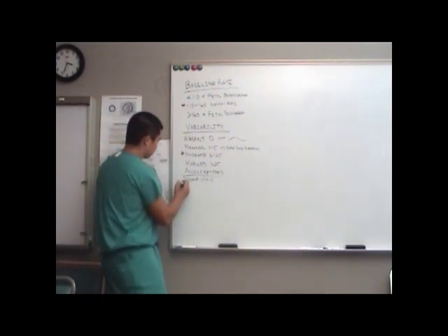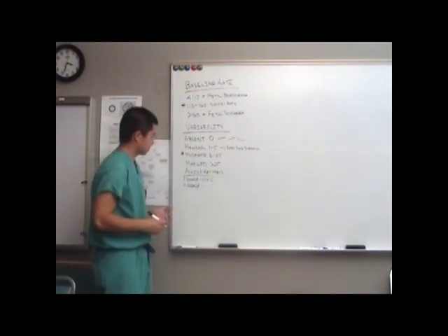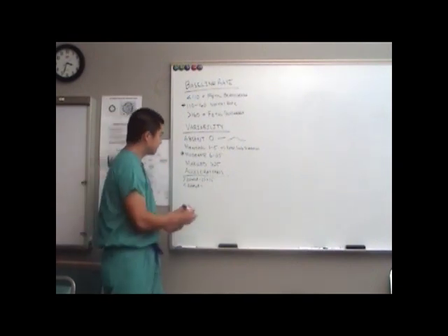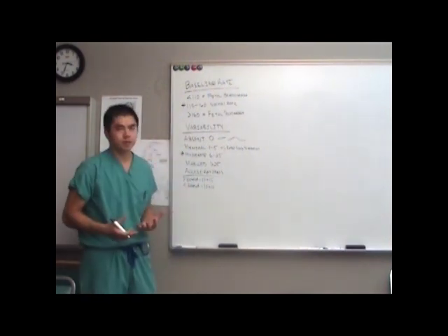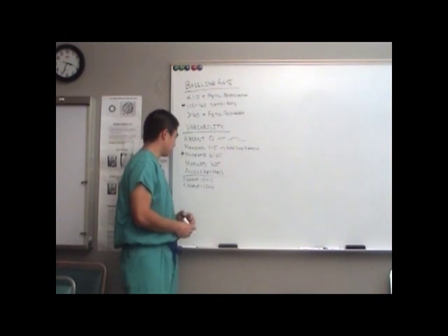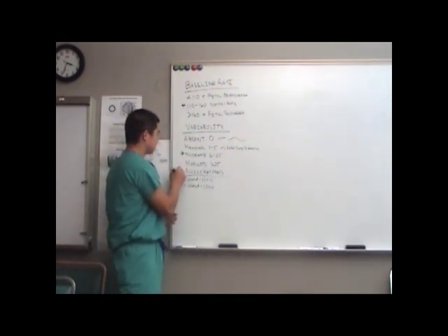Good. Now, if they were less than 32 weeks gestational age, what's the definition? 10 by 10, which is how many boxes by how many boxes? 1 by 1, okay? And so this is above your baseline rate. So accelerations are good things to have.